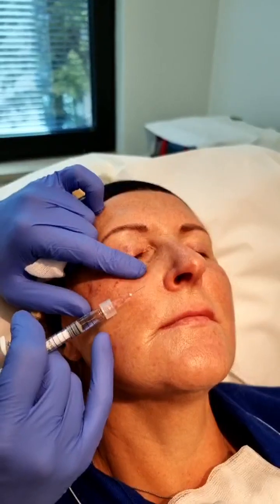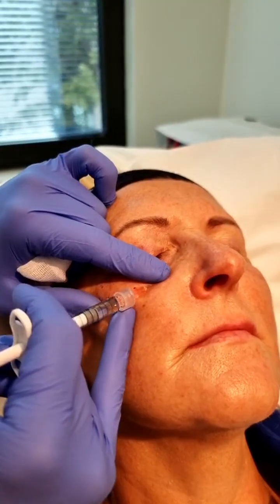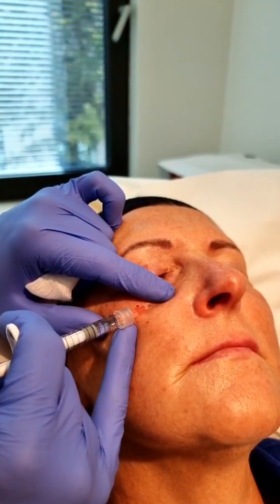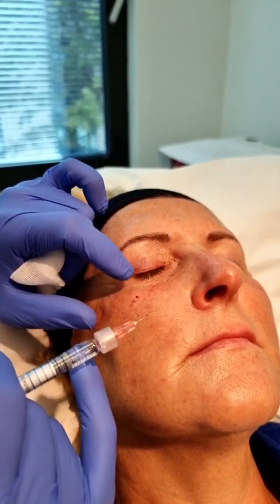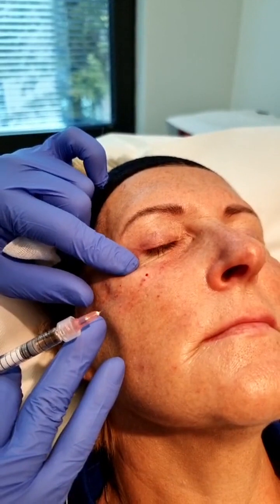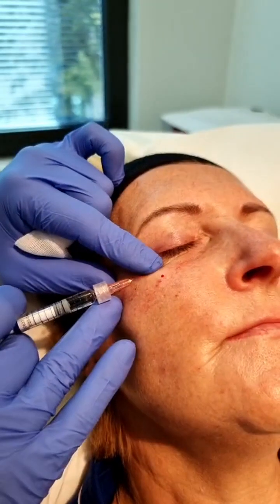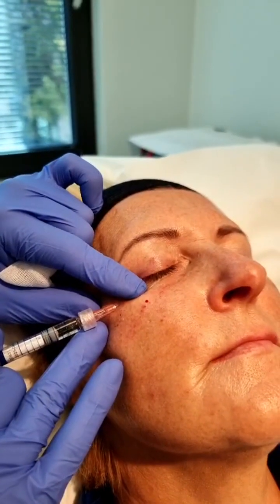You see a flattening here. Oh, we can do a little bit more here. So not responding to what you see, but responding to what you feel. That's actually the difference in what I teach you as opposed to what you might have seen before. You can feel it in yourself. There's a lack of fat here. You can move about 0.05 here.